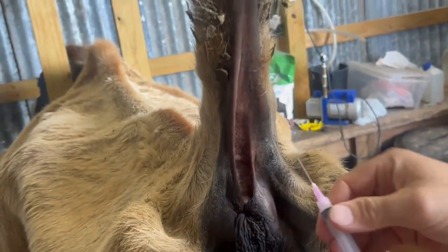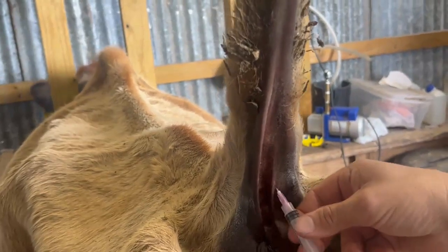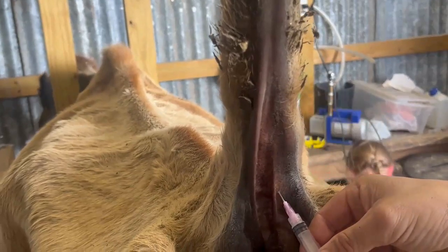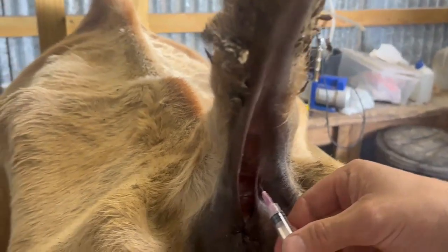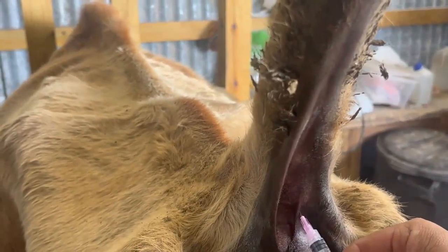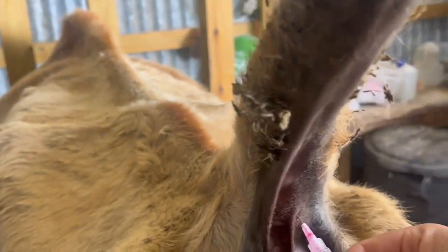This can sometimes take a few tries to get it right. You want to kind of do it quick, then back it off just a hair if you need to. Let's try it again. Nope, still didn't get it — so you can see this can be kind of a challenging process.